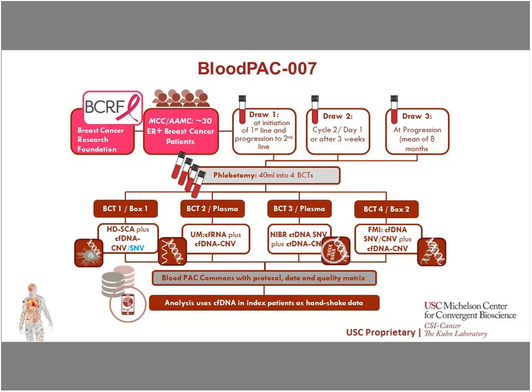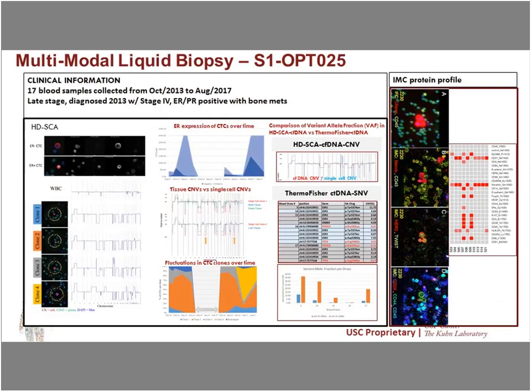So here is the next slide. Here is one poster case showing what our data package will look like for one patient. On the very top is the clinical information. Right down there is the immunofluorescence expression of estrogen receptor on HD-SCA analysis.